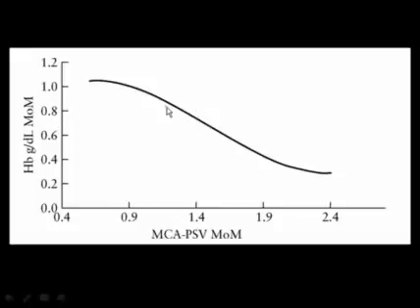And what we were missing was the relationship between the hemoglobin, and here it is reported as multiples of the median, and the middle cerebral artery peak systolic velocity reported as multiples of the median. One of my former fellows, Utgo Oz, was studying this with me, and I remember that when Utgo showed me this graph, I think we realized what we had missed for a long time.